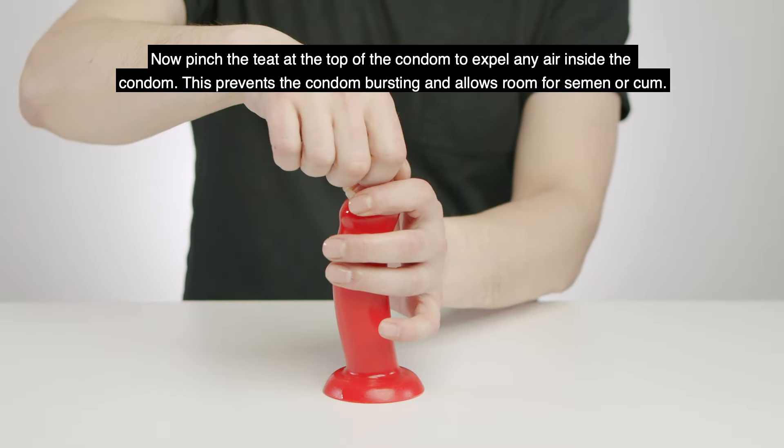Now pinch the teat at the top of the condom to expel any air inside. This prevents the condom bursting and allows room for semen.